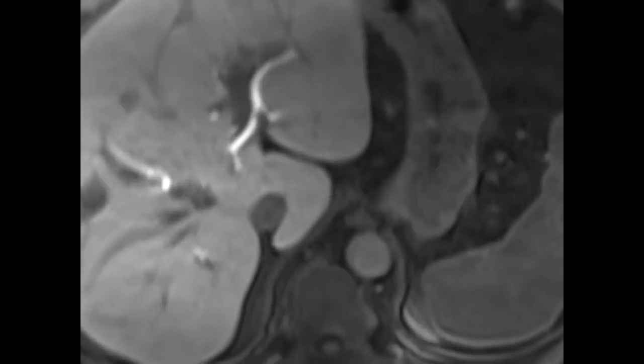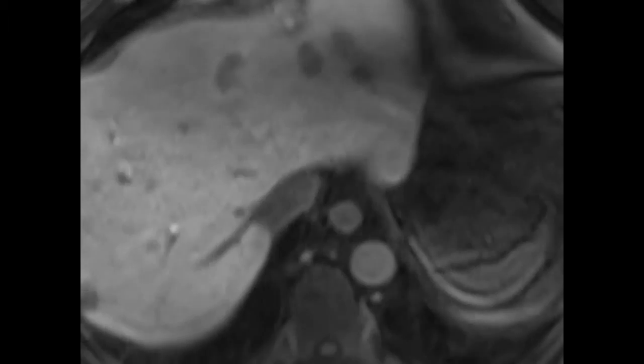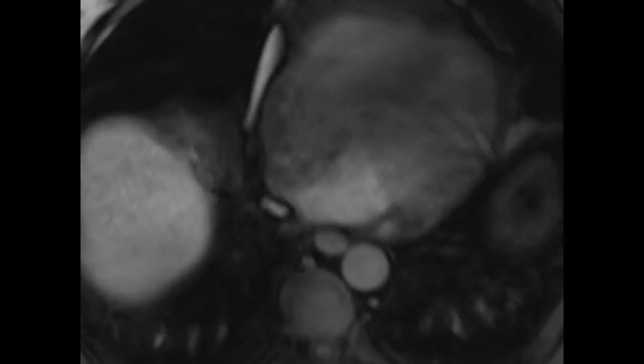On this MRI we can see that a cycle of chemotherapy has been performed successfully in the patient, as the size of metastasis has reduced and some of them are even not visible anymore.